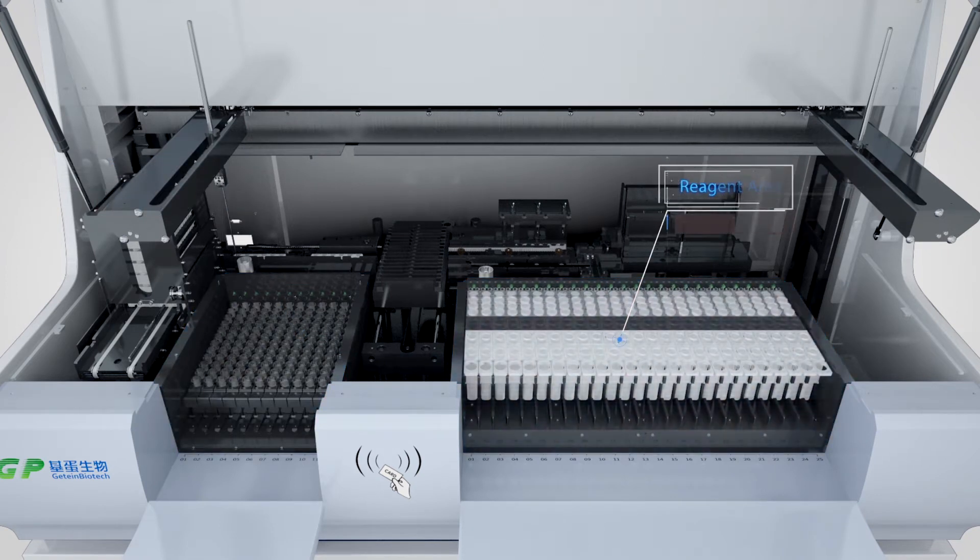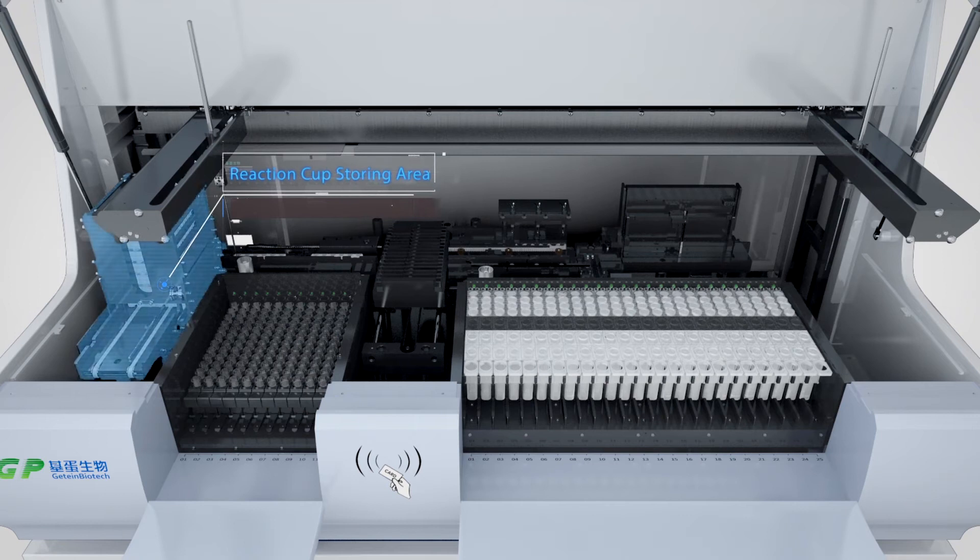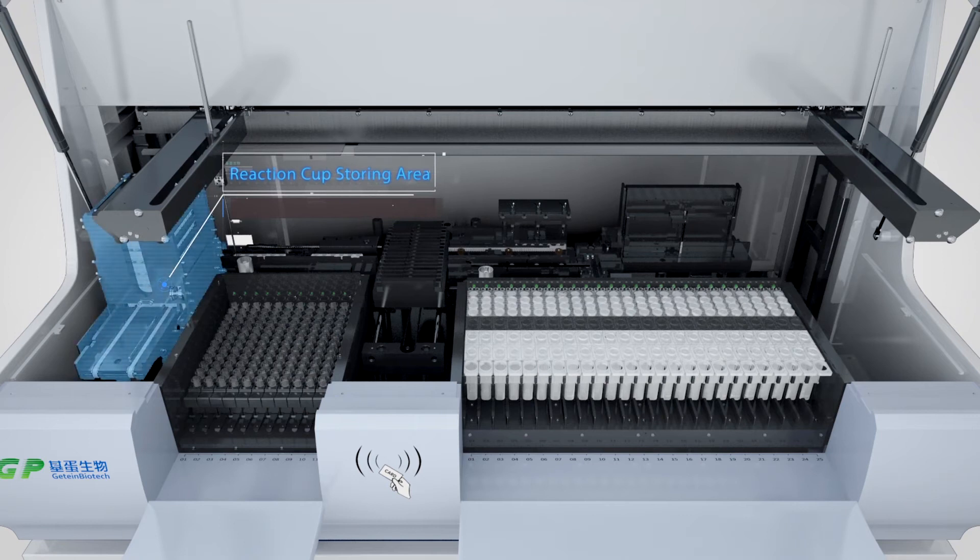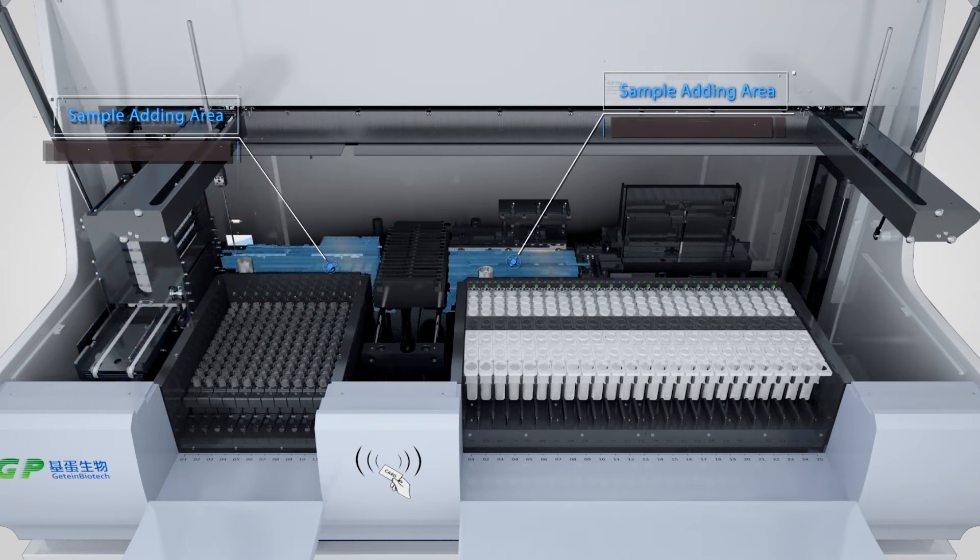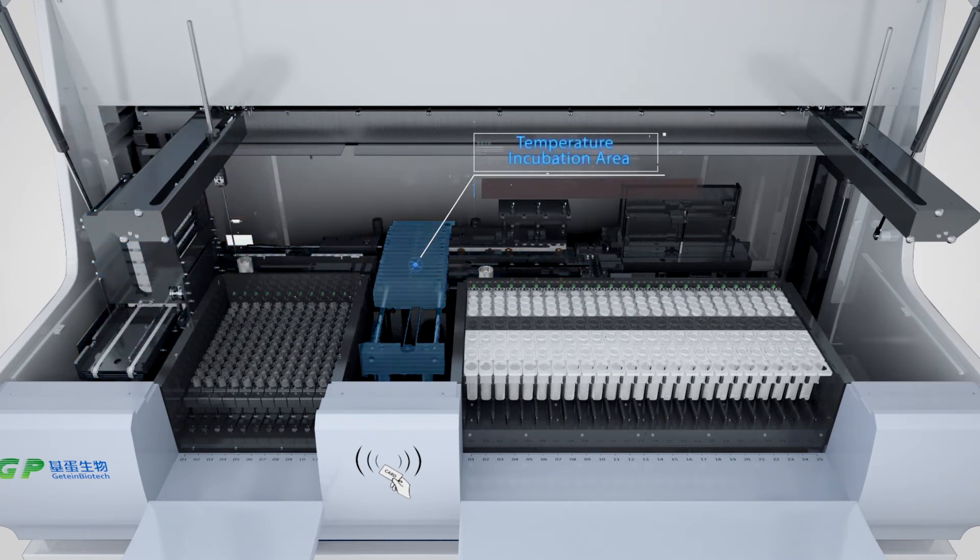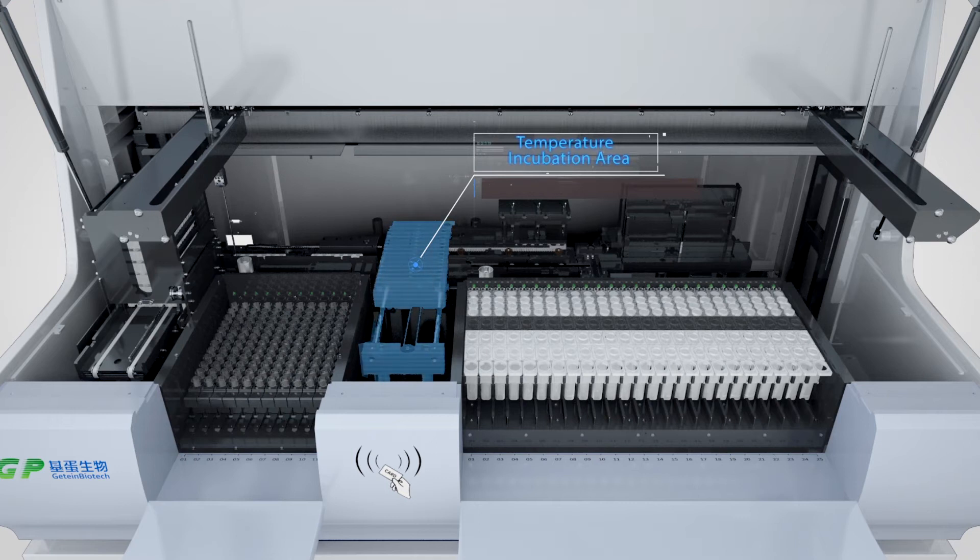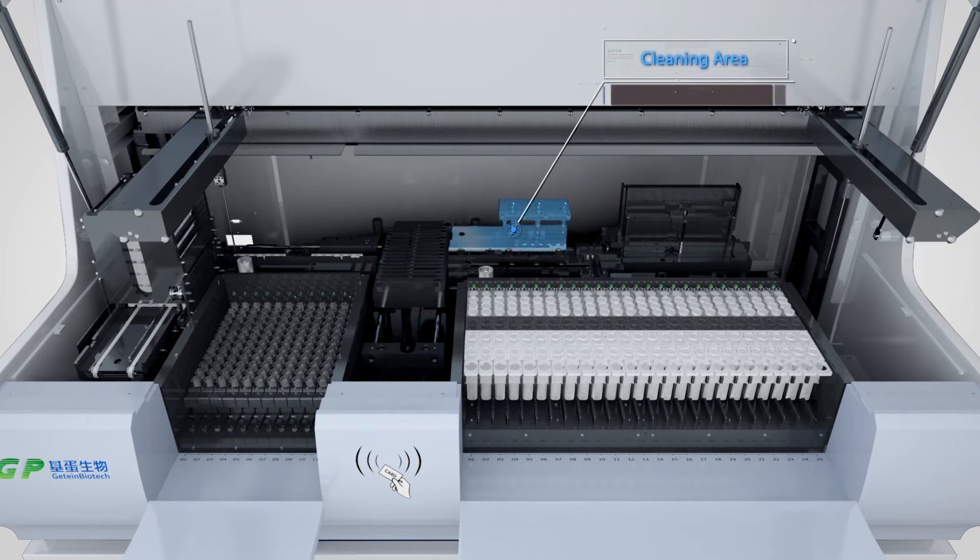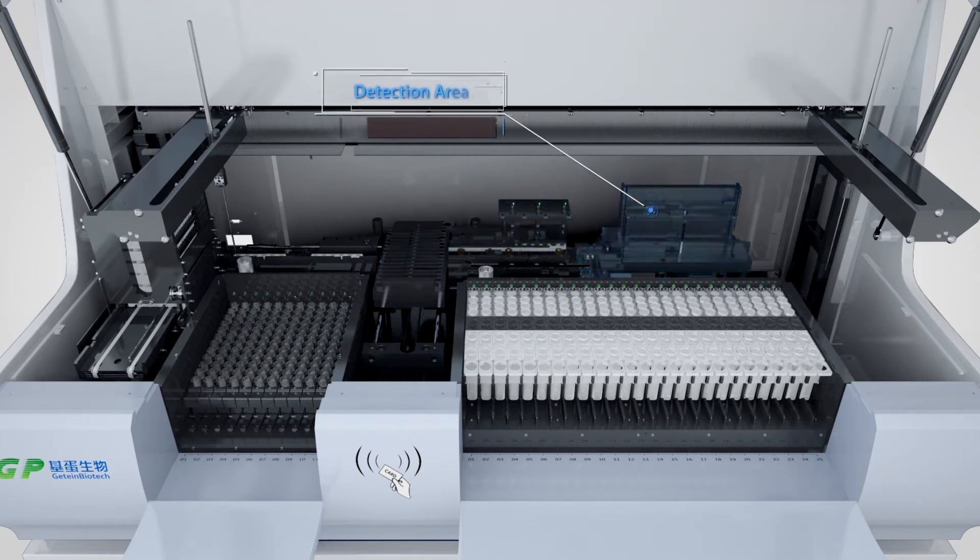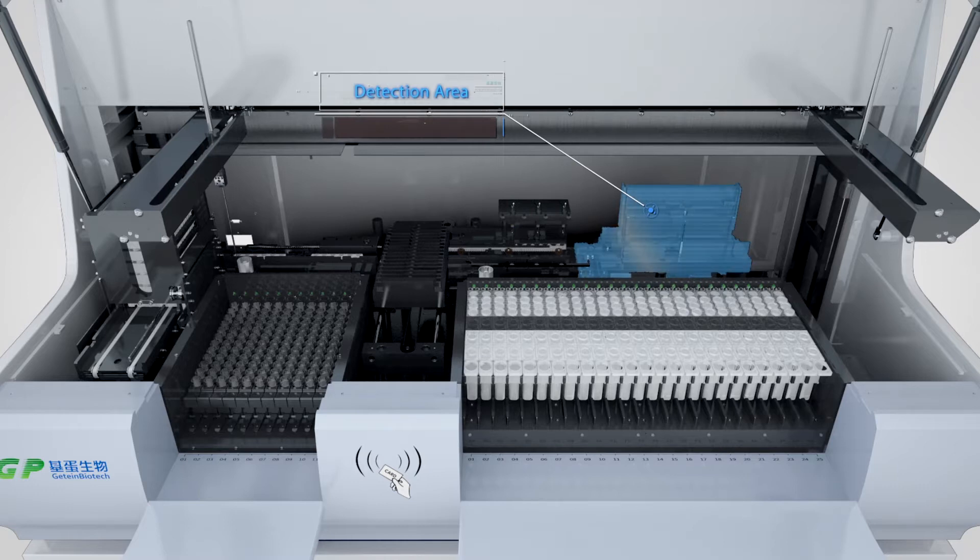sample adding area, temperature incubation area, cleaning area, and detection area.